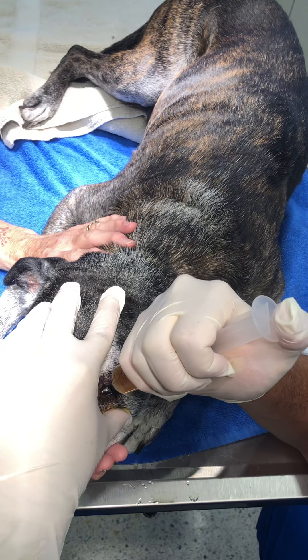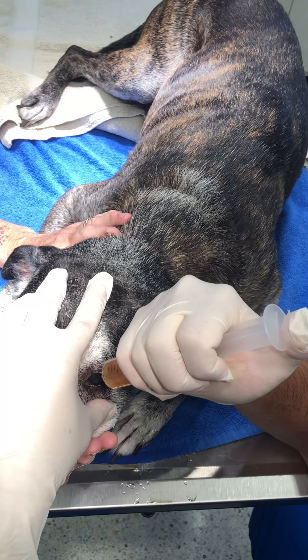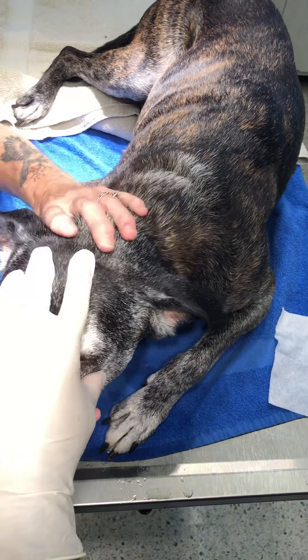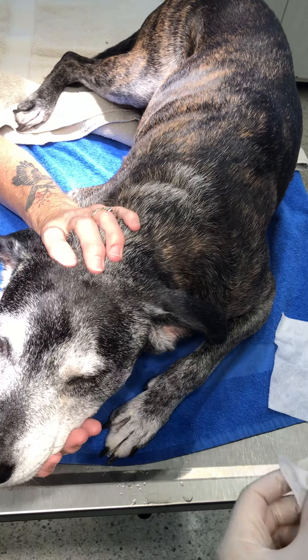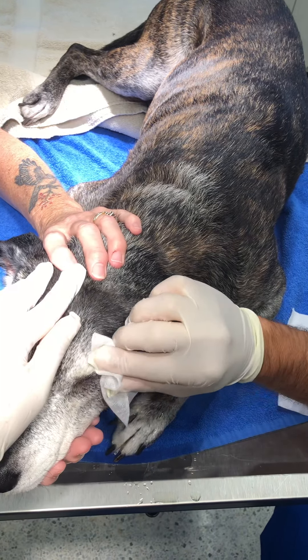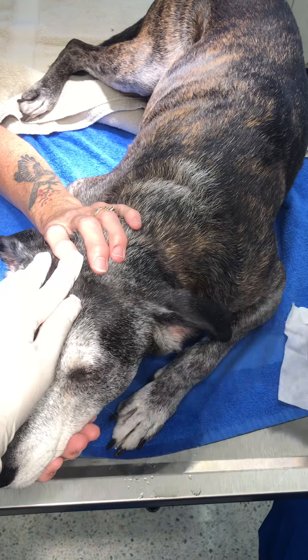Flush the eye again so we don't have contamination. She seems to react a little bit to the flushing — maybe a little bit more sedation next time — but I think we're going to be able to continue.